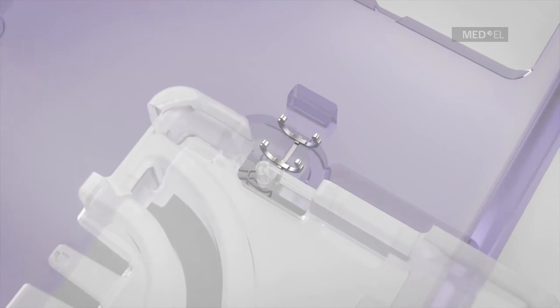So the FMT is correctly connected to the conductor link, it should lie in the groove of the holding frame.